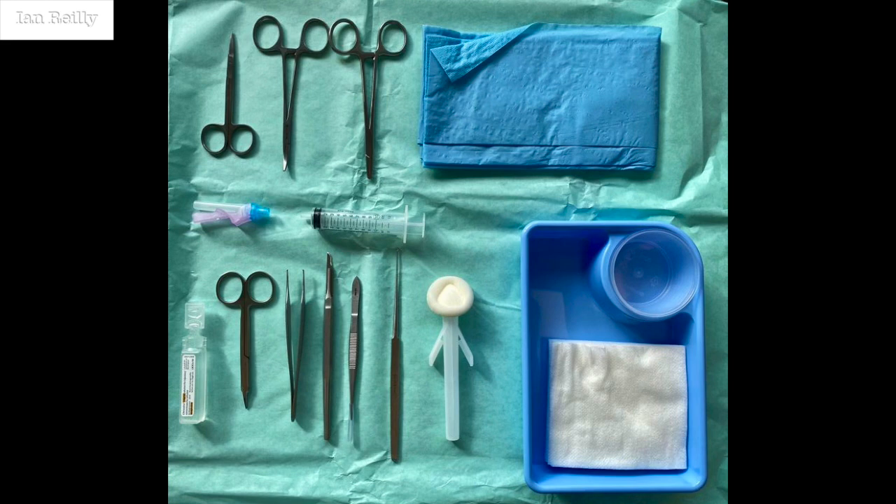Knife, fork and spoon really — in terms of some forceps and a 15 blade. Curettage is an option, but I'll talk again in some other videos about why I prefer a full thickness excision to a typical curettage.